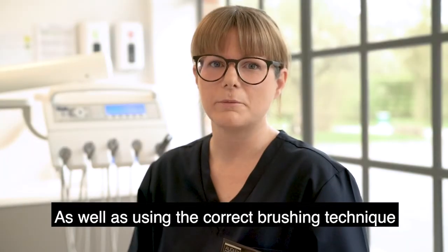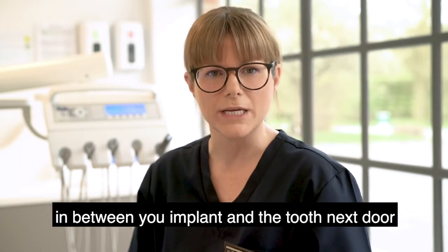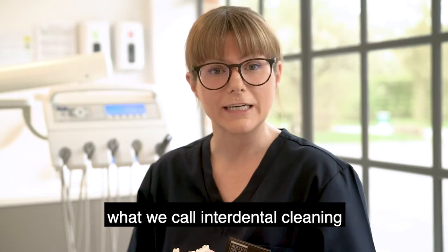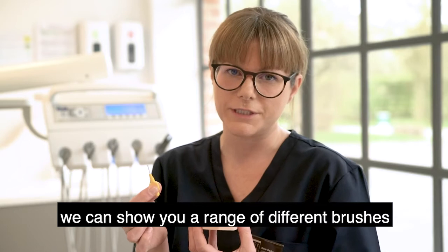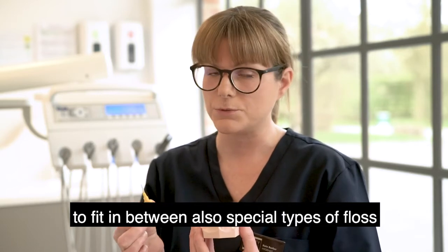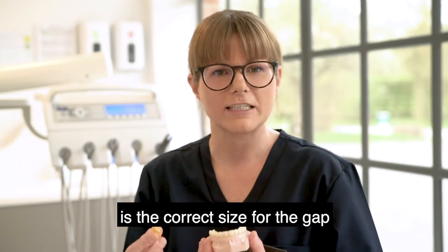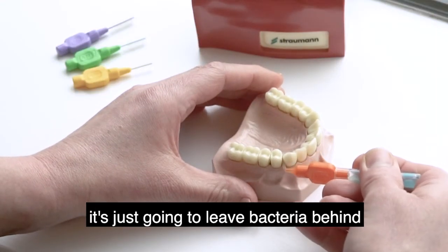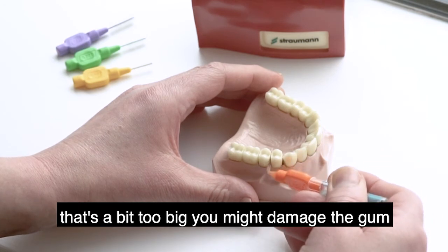As well as using the correct brushing technique, it's really important that we show you how to clean in between your implant and the tooth next door, or what we call interdental cleaning. We can show you a range of different brushes to fit in between, also special types of floss. The most important thing is that we show you the correct size for the gap. If you're using something that's too small, it's just going to leave bacteria behind, and if you're trying to force something in that's a bit too big, you might damage the gum.